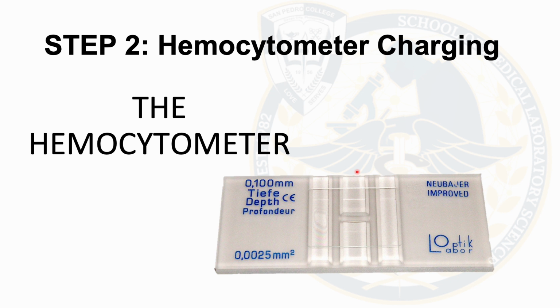By the way, we have a mixer pipette. We have a mixer pipette, but I'd like you to know that some labs really have no mixer. So, all you have to do is just shake. It has a bead inside. The bead itself will help you mix the solvent and the solute.